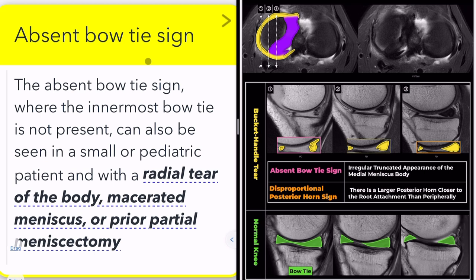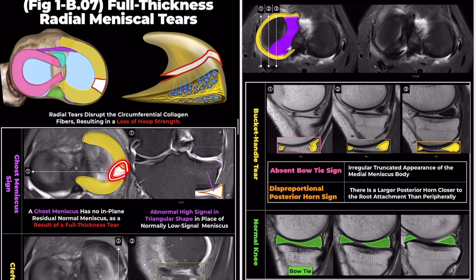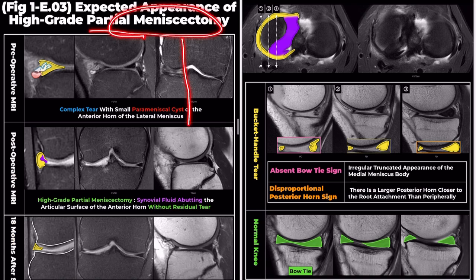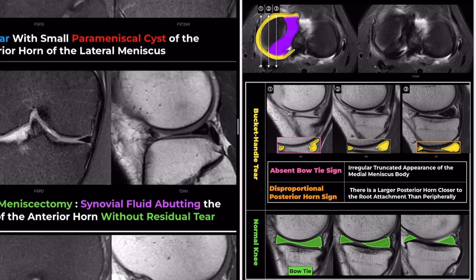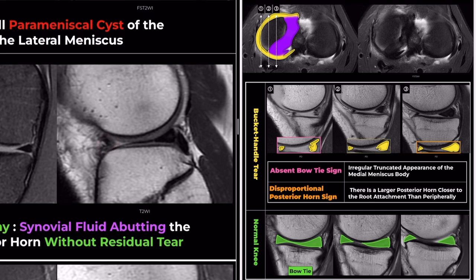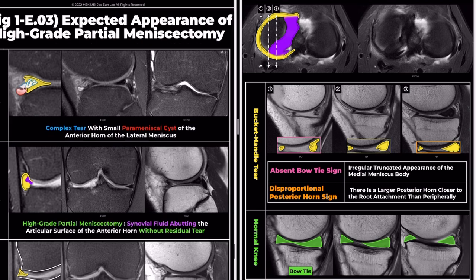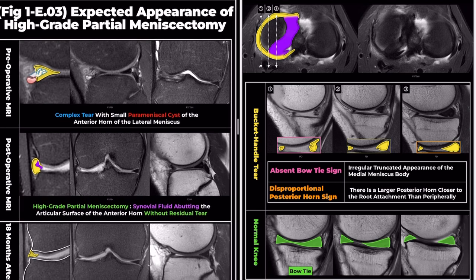In bucket-handle tears, such as this one, the meniscus shows displacement toward the intercondylar notch, the innermost bow-tie is not visible, and the anterior and posterior horns appear irregular and truncated. This patient's images mimic the absent bow-tie sign, attributed to a full-thickness radial tear. The next case, where the patient underwent a partial meniscectomy resulting in a markedly small anterior horn, also resembles the absent bow-tie sign. Therefore, the absent bow-tie sign can be considered a nonspecific finding.